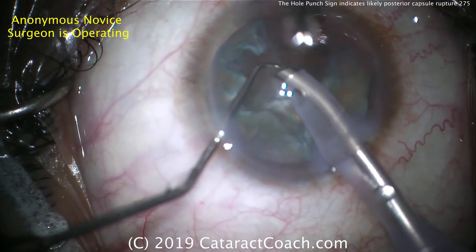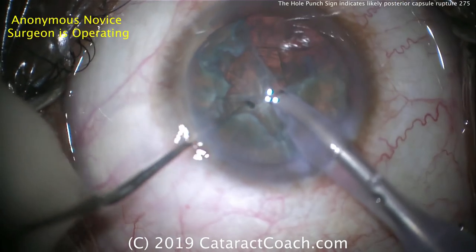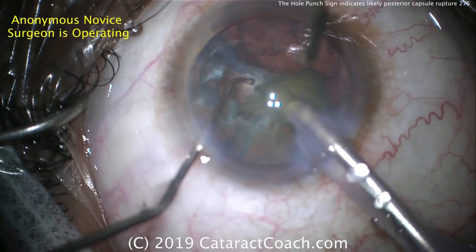The surgeon persisted and removed a different quadrant. Now one of the four quadrants is out, and then slowly but surely the other quadrants will be removed.